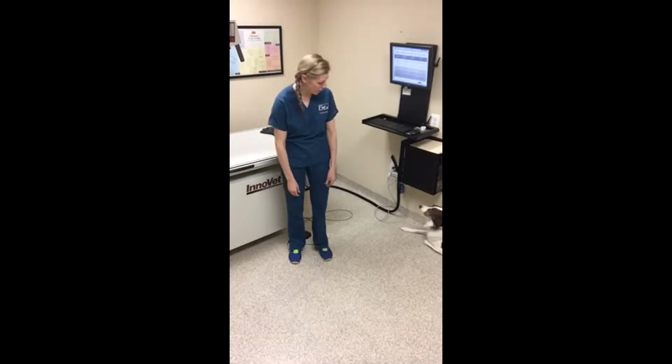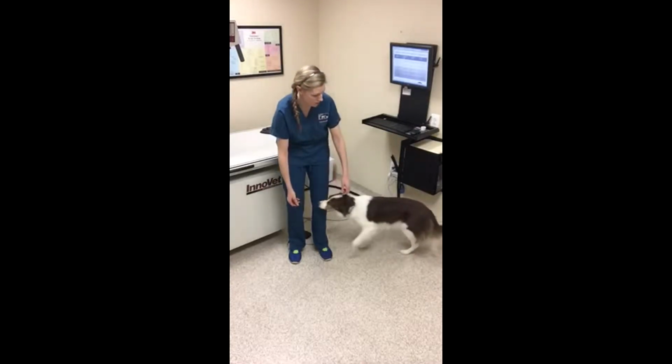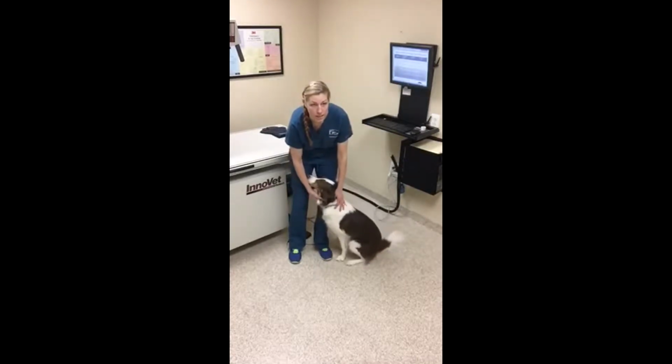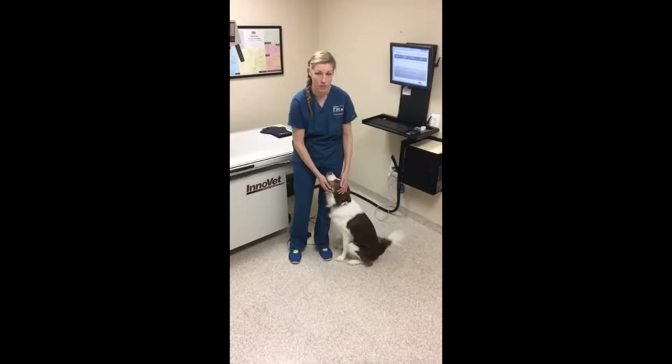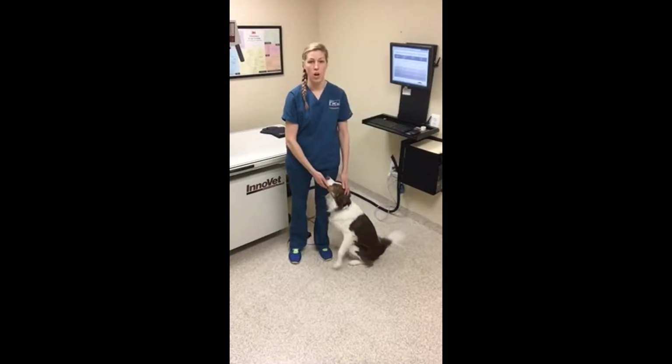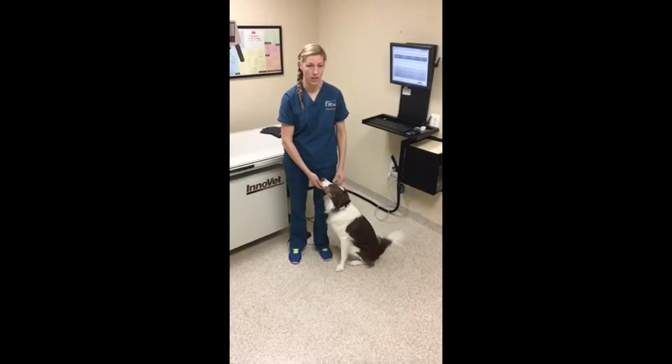The technique chart we are going to create today is a variable kVp chart formulated using a series of trial and error exposures. It is necessary to standardize as many variable factors as possible before starting the trial exposures. Once this is done, you will need to select an appropriate patient. An average sized dog, so one that is about 40 to 50 pounds and has a lateral abdominal measurement of 15 centimeters, with a clean coat and that's either calm or anesthetized, is an ideal candidate.